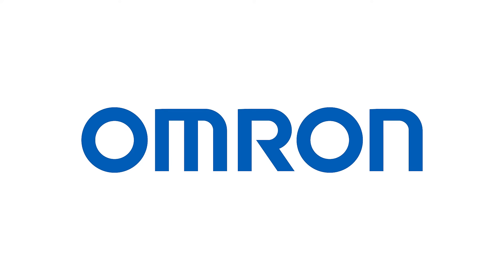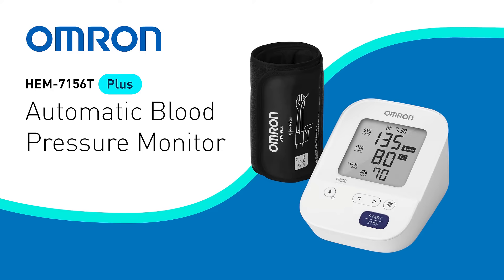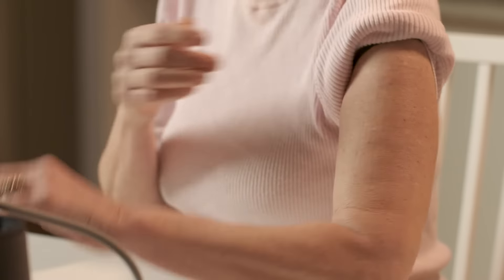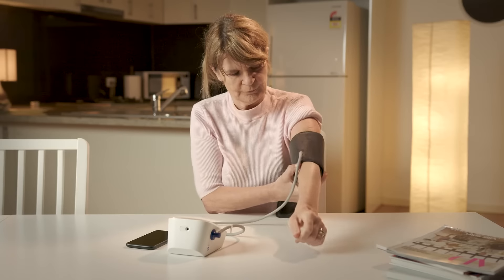Accuracy is one of the most important requirements in blood pressure monitoring. With IntelliWrap 360 degree accuracy, Omron's HEM7156T Plus blood pressure monitor allows you to get accurate readings effortlessly, regardless of the angle the cuff is positioned on the upper arm. Get the same accuracy as you would in your doctor's office.